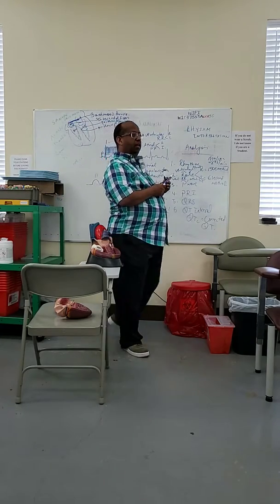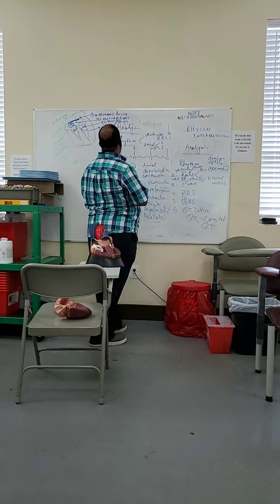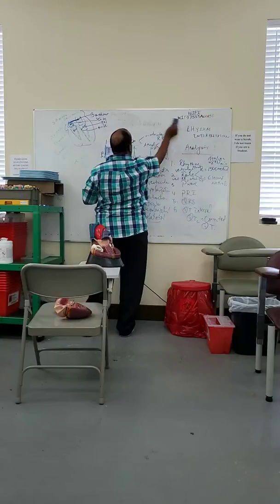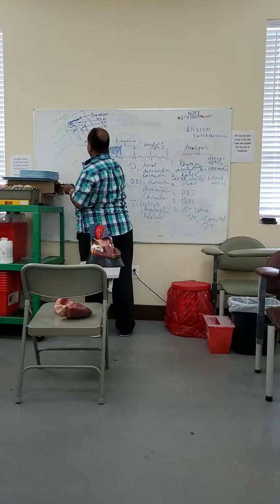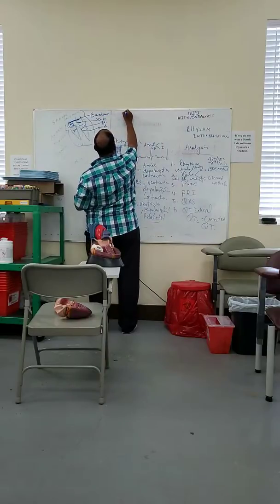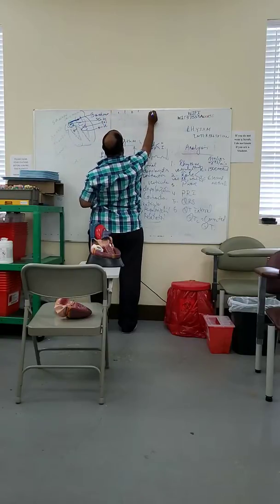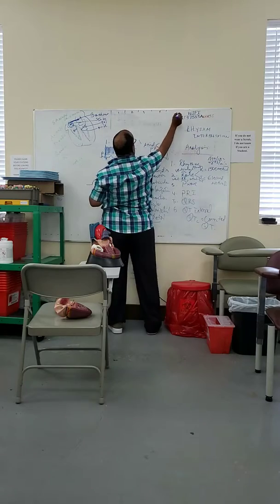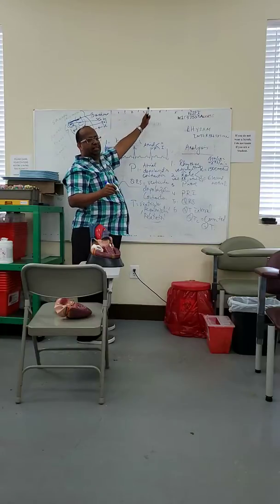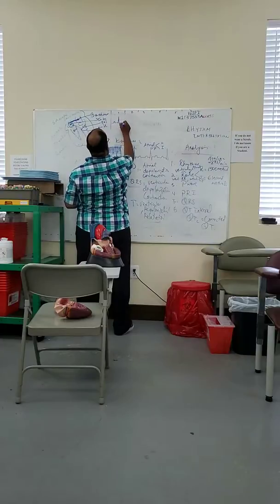Yes. So for the 6-second method, what is it? Oh yeah, it's a good question. 6-second method means in your EKG strip, take a 6-second gap. So you have the EKG strip, let's say, and on top there are small lines that are 1 second each. So 1 second, 2, 3, 4, 5, 6. So you take the 6-second strip, and then count how many, what?